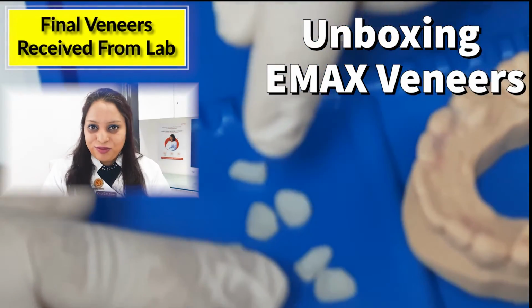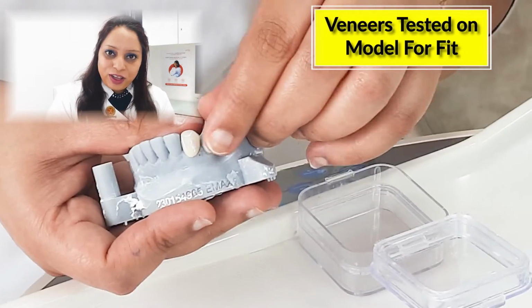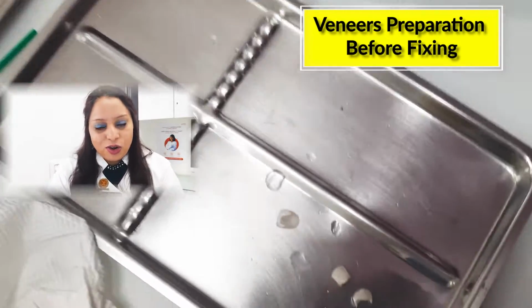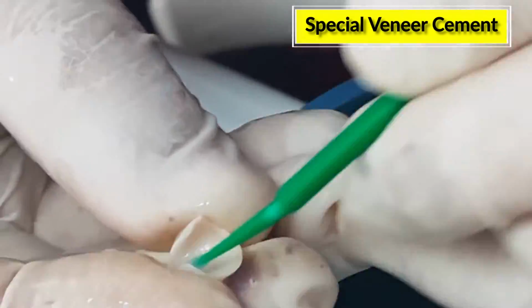Once we receive the final veneers back from the lab, we check the fit on the model first before giving an appointment to the patient. And in the clinical sitting, first we check these in the mouth, and once both patient and doctor are satisfied, we glue them using a special veneer cement.